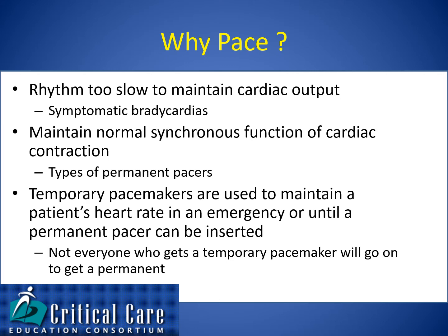We also will use pacers as a temporary measure to maintain the patient's heart rate in an emergency situation. So not everyone who gets a temporary pacer will have a permanent pacer. In the setting of an acute MI, patients may have transient bradycardias due to inflammation or injury to the conduction system from the ischemia that may improve in a few days, and they don't end up needing a permanent pacer. And not everyone who gets a permanent pacer will have needed a temporary.